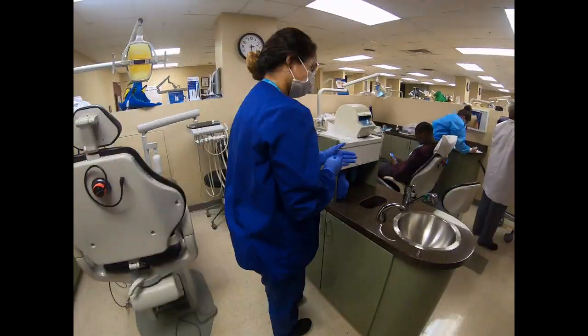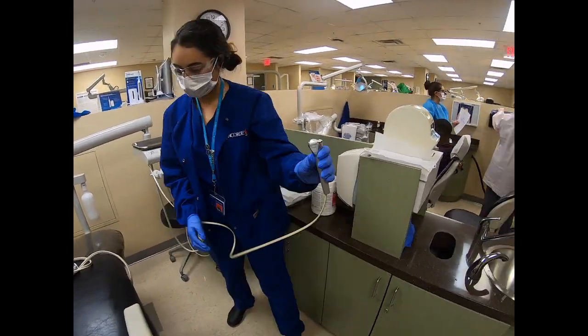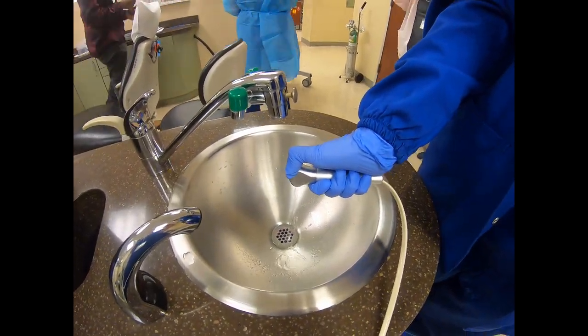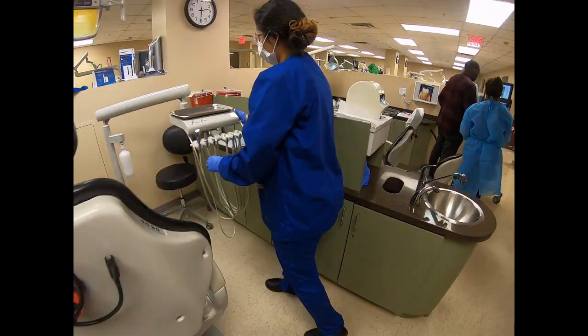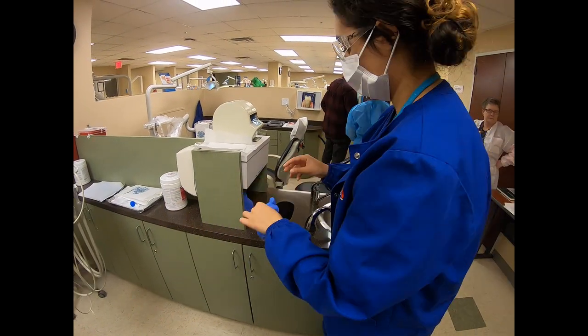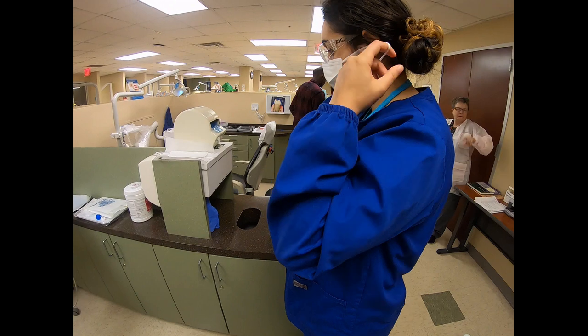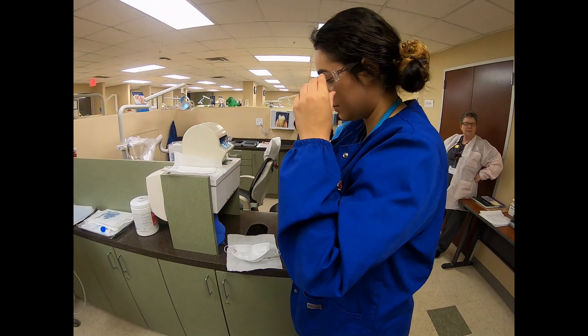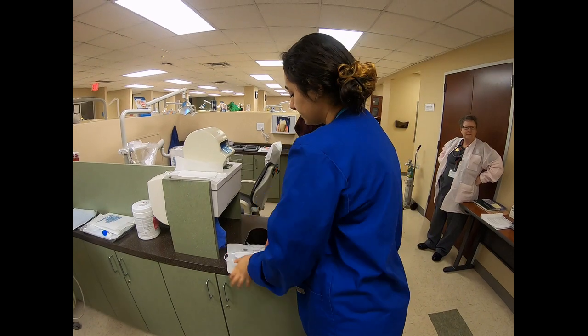Once the room is disinfected, turn on the master switch of the unit and flush the air water syringe for 2 minutes at the beginning of the day and 30 seconds in between patients. Now that the room is completely disinfected, remove your gloves, goggles, and mask, and place the mask and goggles on a clean paper towel or tray cover. Sanitize your hands.